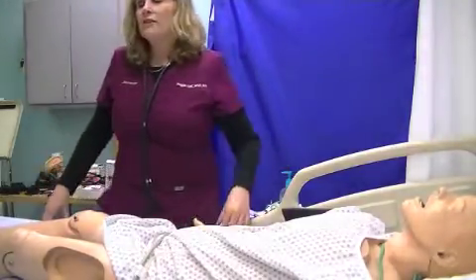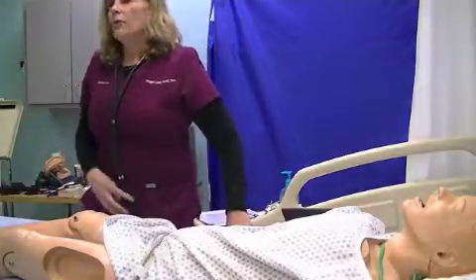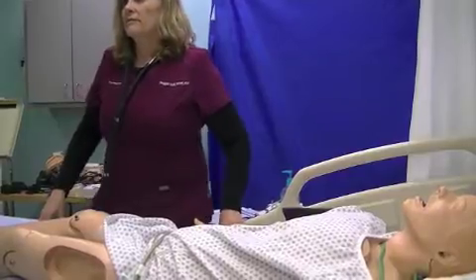Also, if they have a dialysis shunt, meaning if they're a kidney patient, and you try to put this on the shunt, you can clot off the shunt. You don't want that to happen.